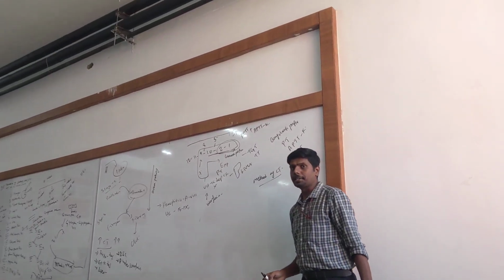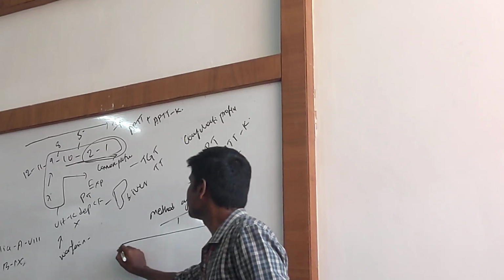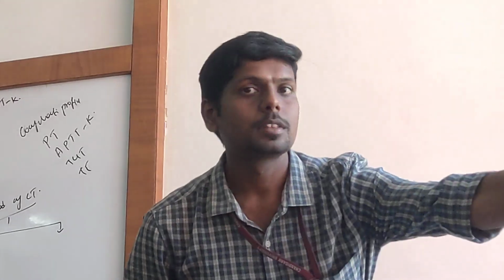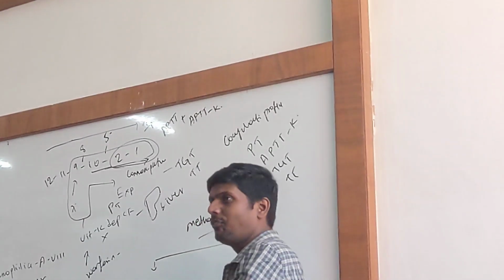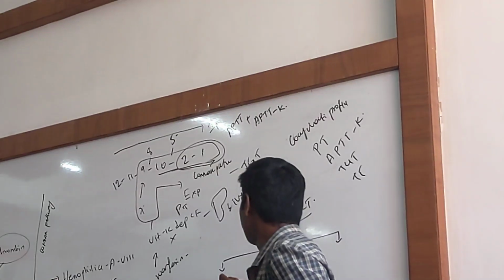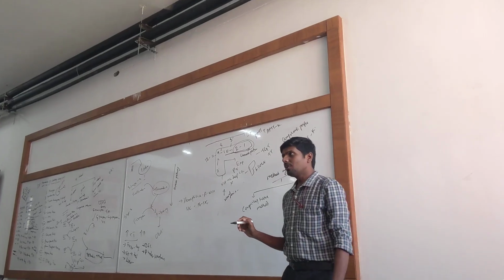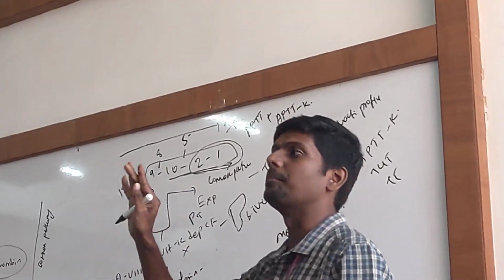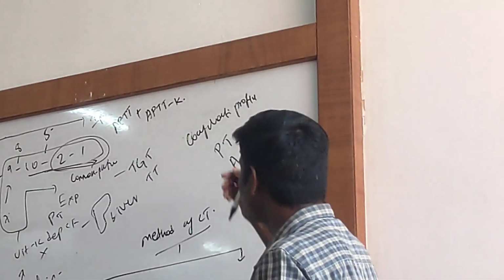Methods of clotting time estimation. There are two methods. Write down the methods. Before telling you, first method, capillary tube method. Tomorrow in the practical exam, there is a high chance that I might ask either CT or BT as a major practical. So you must learn this by today itself.